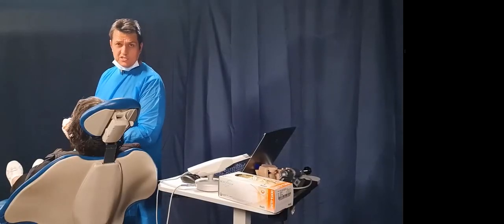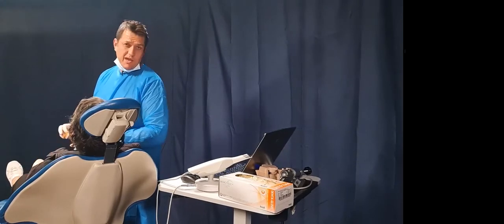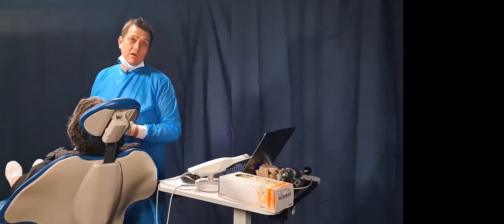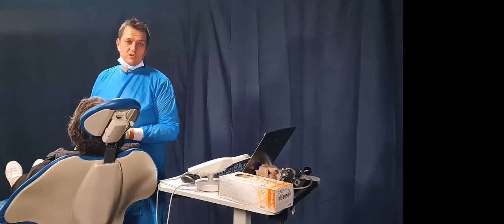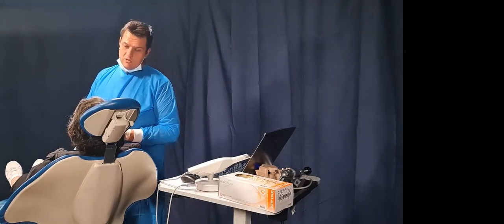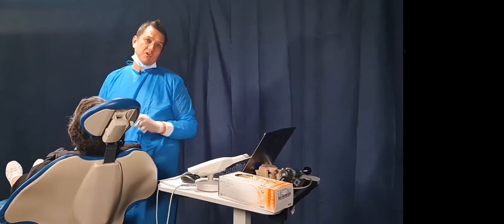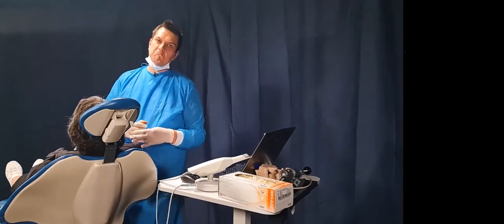And I'm going to show you now how you can sort of marry the old school and the new school. The reason I like this technique so much is because the patient comes in for appointment number 1, presents with dentures that have a decent occlusal record, so they're marrying up okay with their lower. So what you can do is you can do your PVS and you can do what I'm about to show you. You can then record the bite at the same appointment. You can then get your texture and mark some points on the anteriors, and there you'll be able to go straight from your first appointment to your try-in straight away.